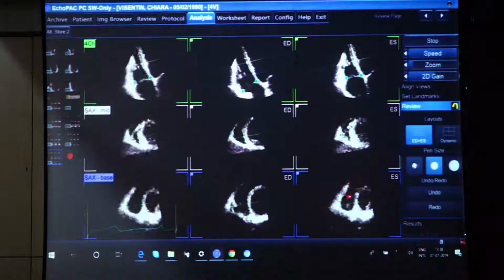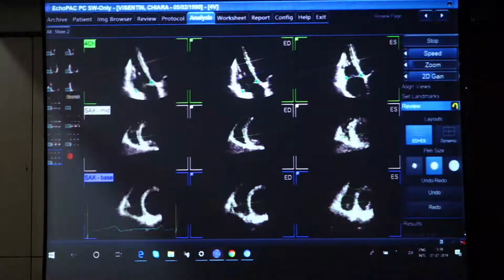Why here do I have a broken endocardium? Oh, that is because of the right bundle branch. Yep. This is the right ventricular outflow tract, and there is the aorta that is crossing at this level. When the left ventricle shortens in systole, the aorta comes into your cutting plane. And so this is the right ventricular outflow tract, and this is the right ventricular inflow tract, and they are separated.